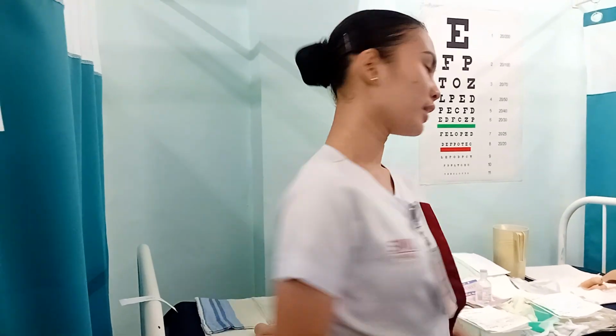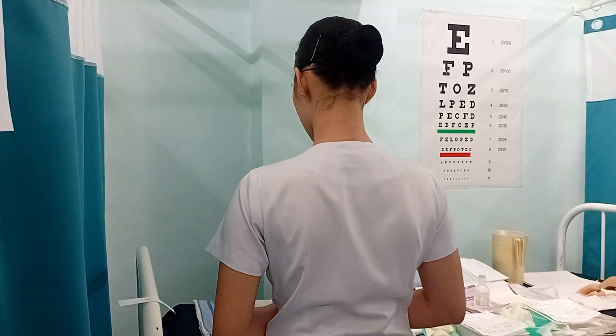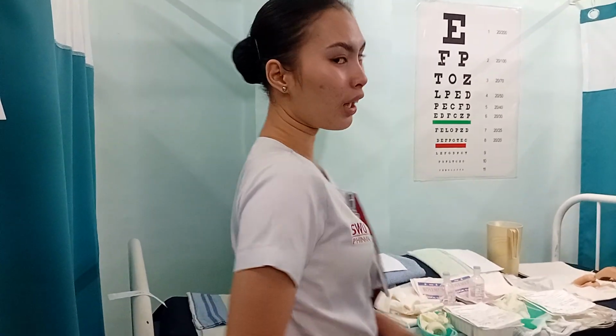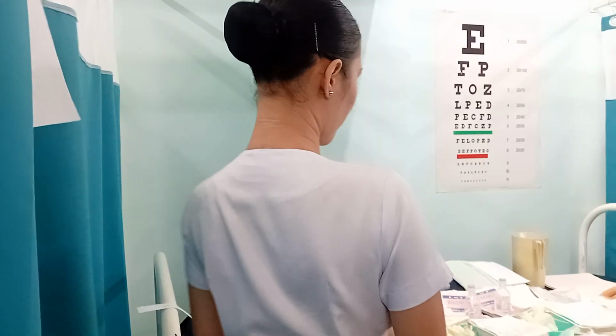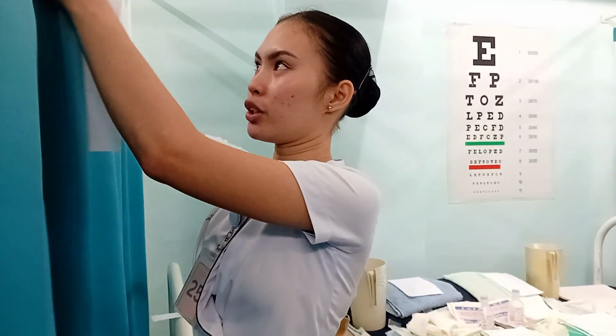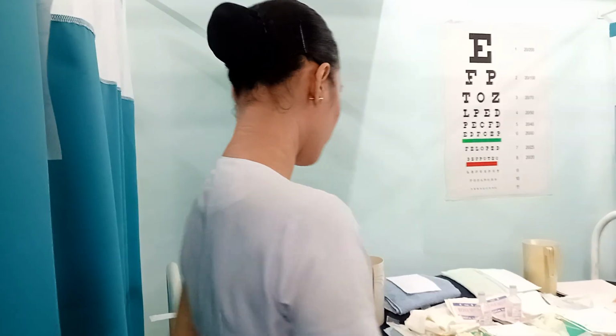Afterwards, I'm going to explain the procedure. And then after, we are going to wash our hands and prepare the equipment. Since you already prepared all the equipment, after we're going to provide guidance for the patient. And then we're going to position the patient.